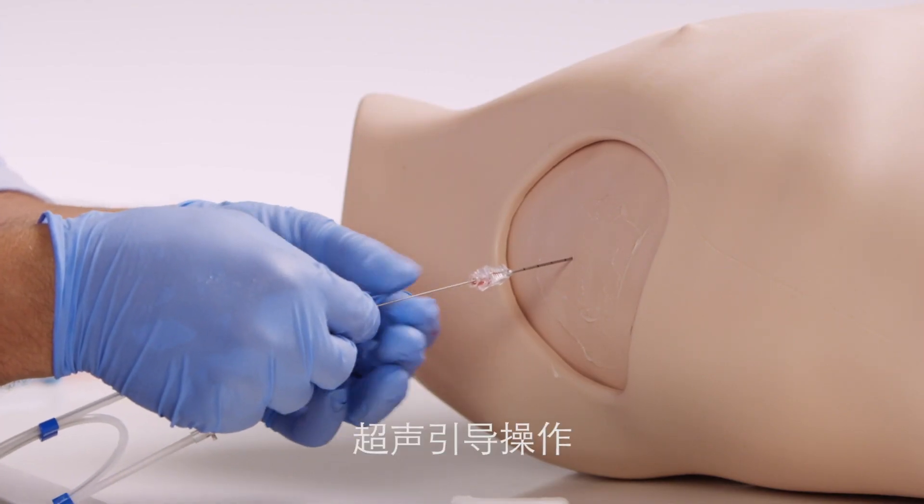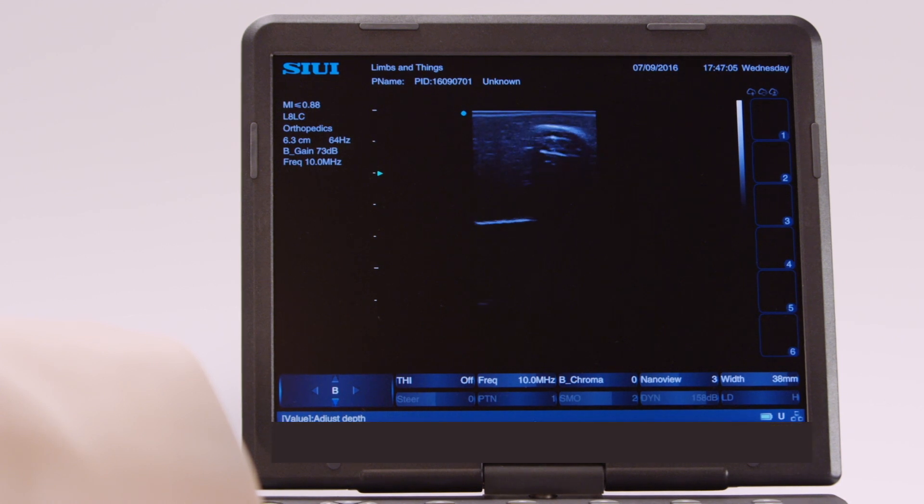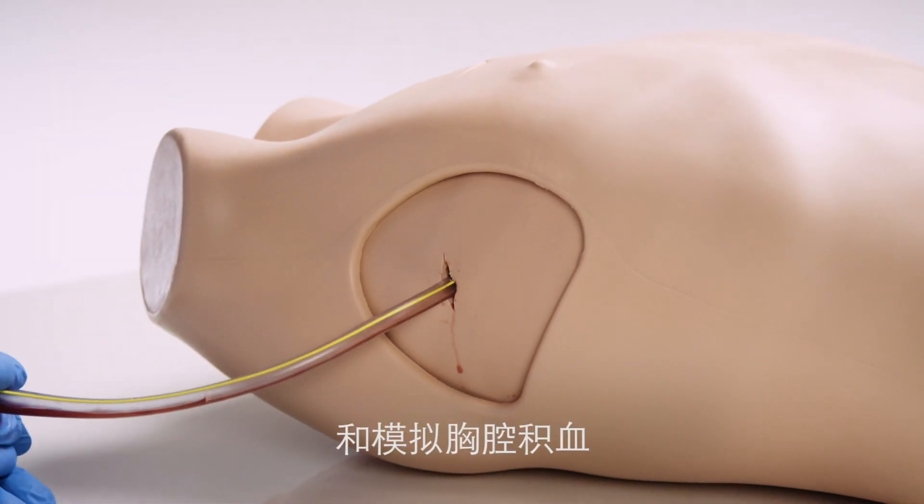The advanced pad is designed for ultrasound-guided procedures, specifically the Seldinger technique, and for hemothorax simulation.